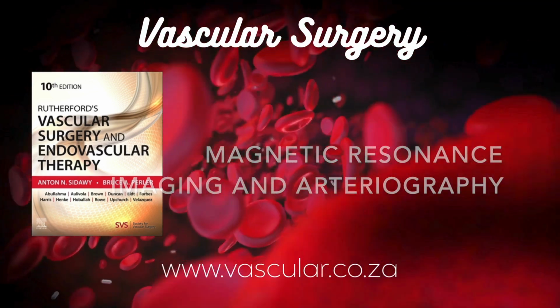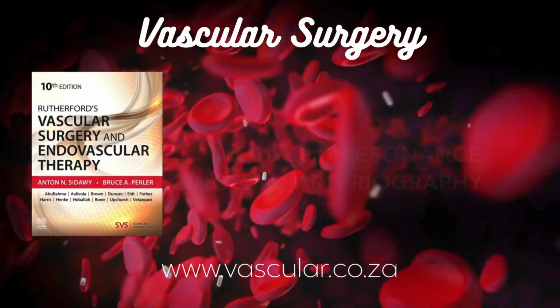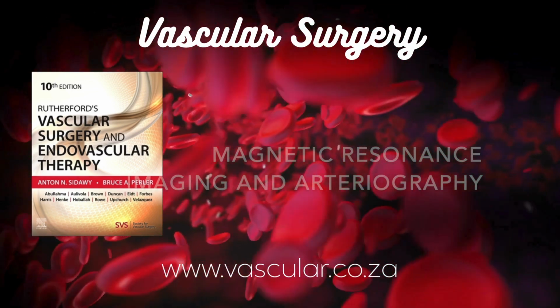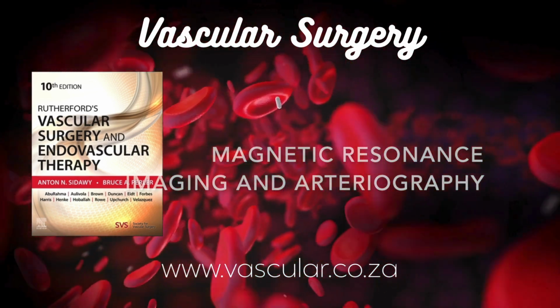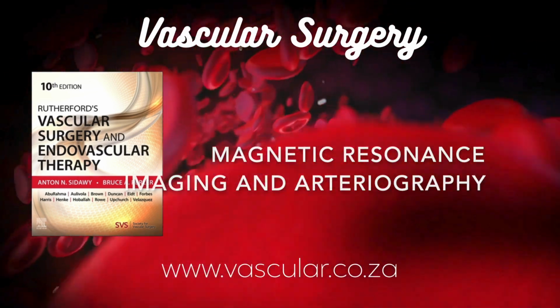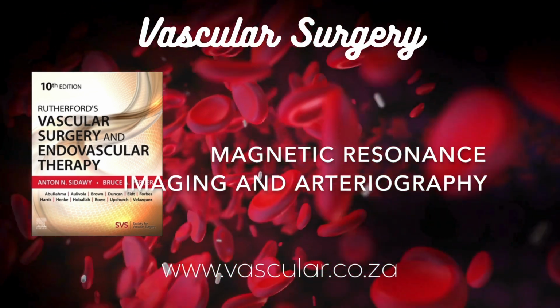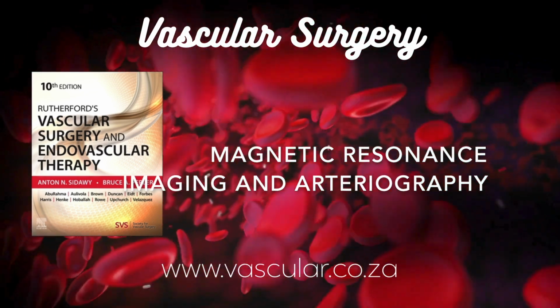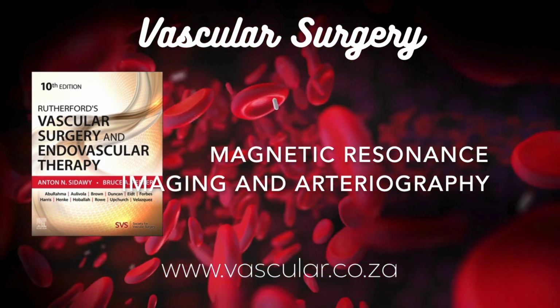And I see it mentions using saturation pulses to selectively suppress arterial or venous signals. How do you do that? Right. Another clever trick. We can apply an extra RF pulse, a saturation pulse, either just upstream or just downstream from the slice we're imaging. Like tagging the blood. Sort of. For example, if we apply a saturation band below an imaging slice in the abdomen, it zaps the signal from venous blood flowing upwards from the legs before it enters the slice.